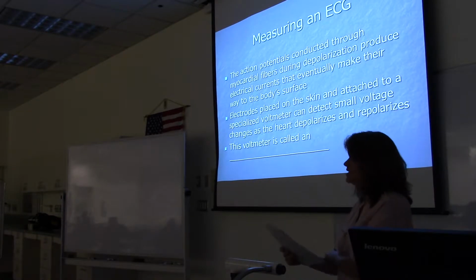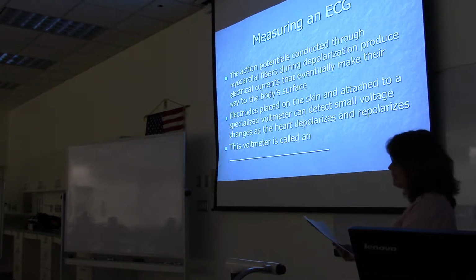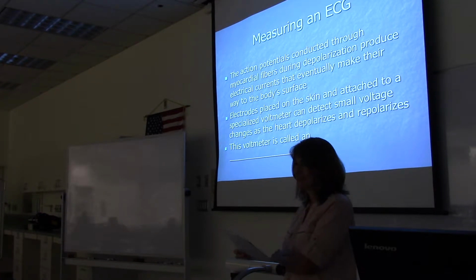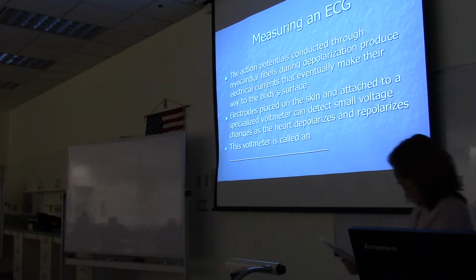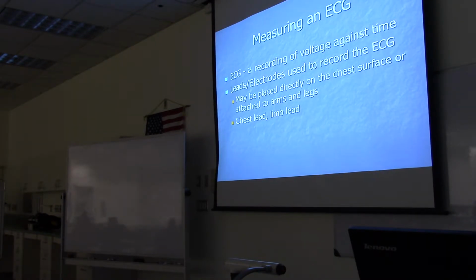And the paper tracing that you get is called an electrocardiogram. So an ECG is a recording of voltage against time.